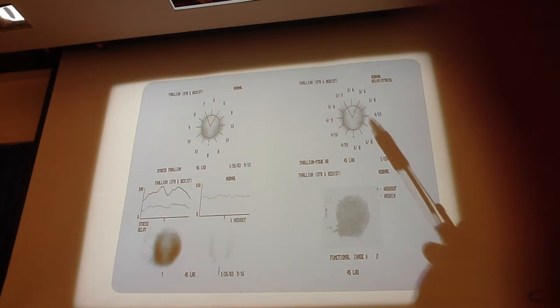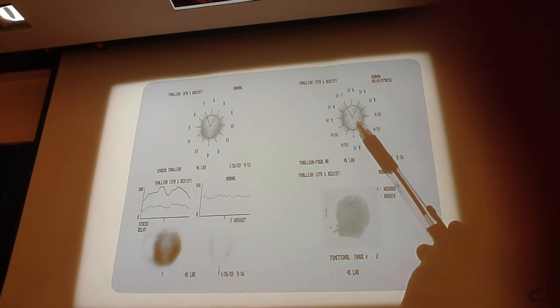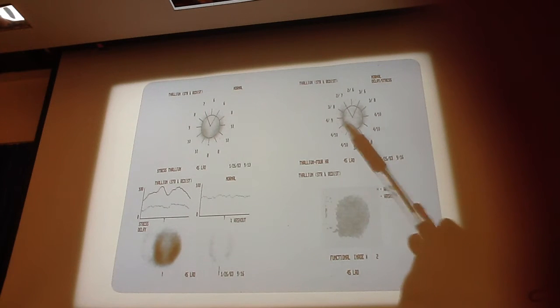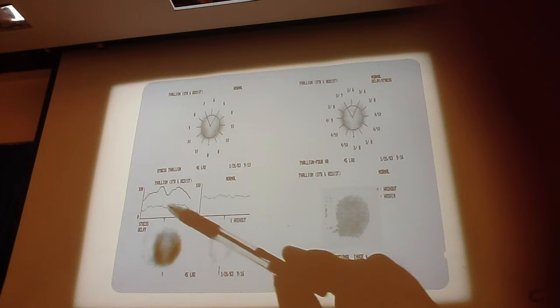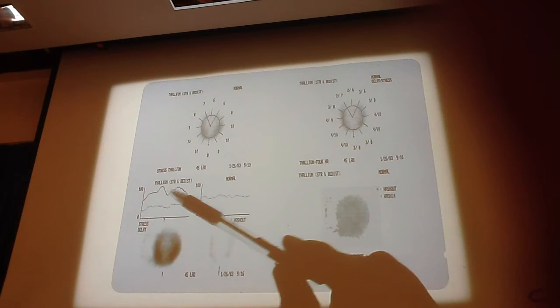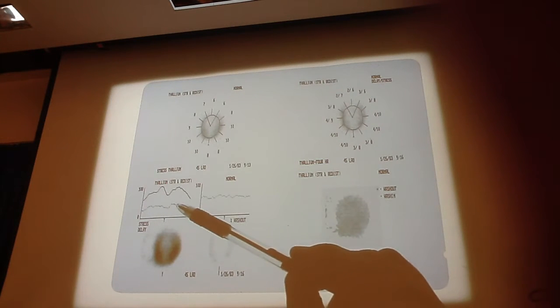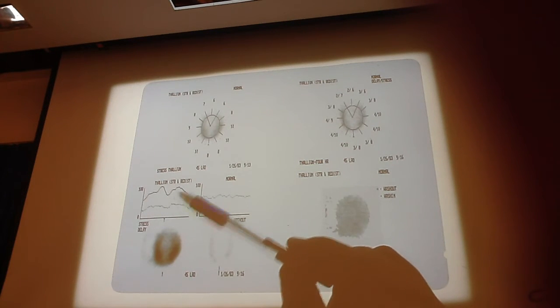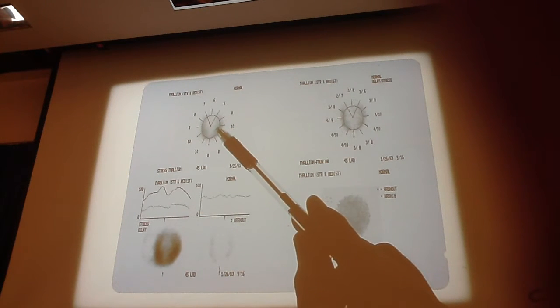Okay, but the thing is that if you understand the physiology of the heart, then you'll understand a lot more of what we're doing to see it. Okay, so this thing here, like I say, all we're doing here is we're comparing the wash in to the wash out. So this is a fairly normal study here because it's more than 40%. And that's why the printout here, this shows the stress distribution of the radiopharmaceutical. This is the rest. And so long as there's a difference of 30% all the way through here, then you're good. Have any of you guys done this?